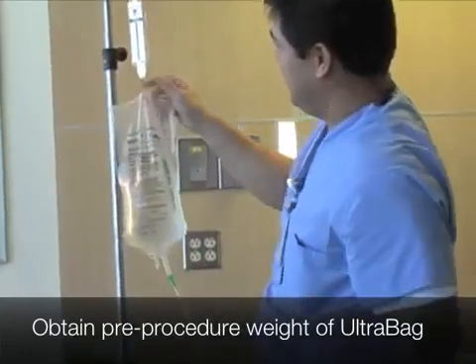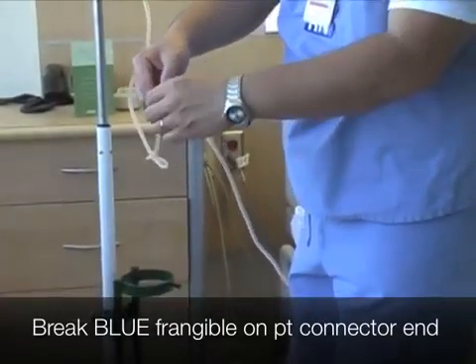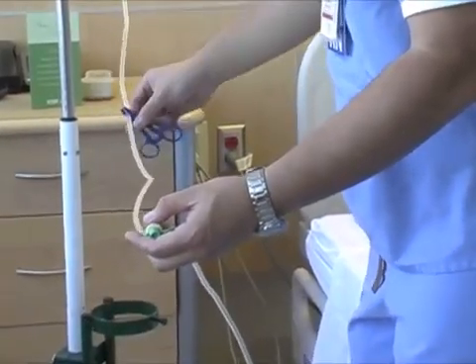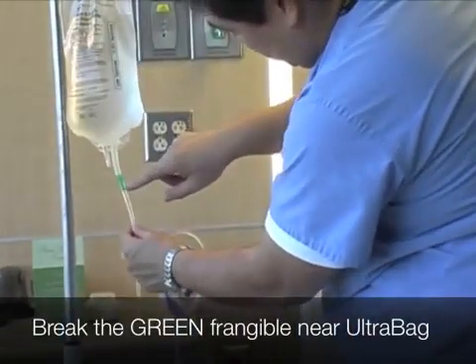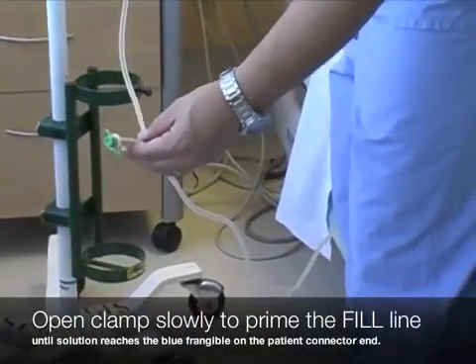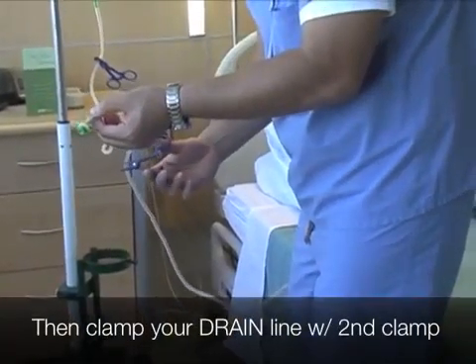Hang ultra bag on IV pole. Place drain bag on floor with clear side up. Break the blue frangible on the patient connector end. Clamp the fill line using the first clamp. Then break the green frangible near the solution bag. Open clamp slowly to prime the tubing from the fill line until the solution reaches the blue frangible in the patient's connector end. After priming fill line, clamp again, then clamp your drain line with second clamp.